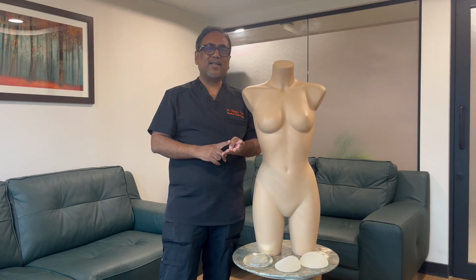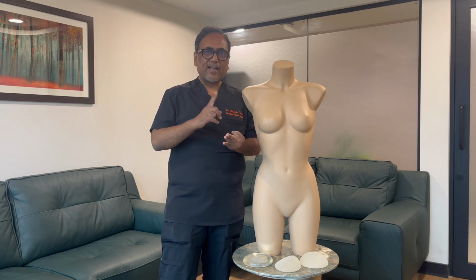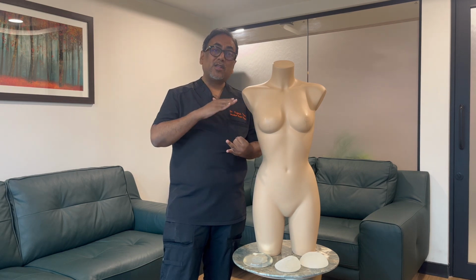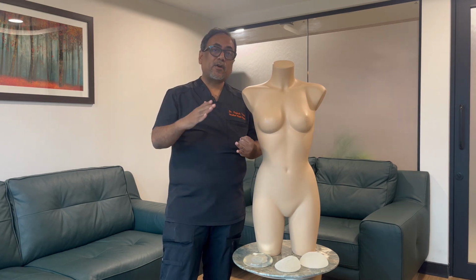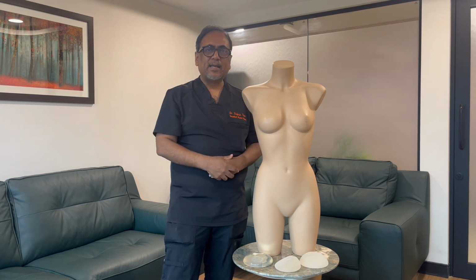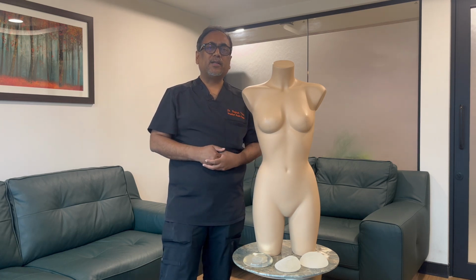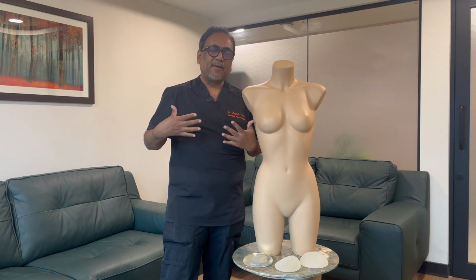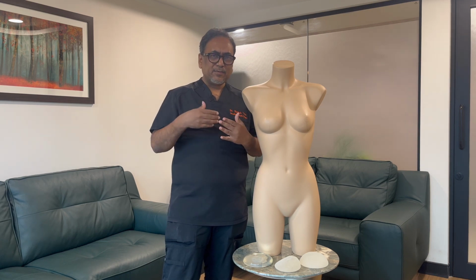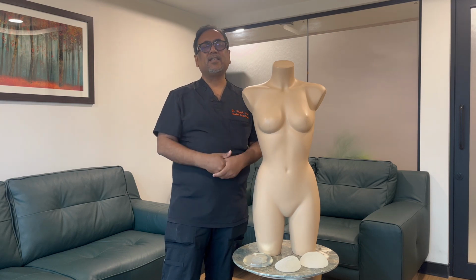So this is what happens in our practice. The first process is getting to know our patients, getting to know their expectations, whether they're realistic, whether they're exaggerated, and then educating this patient, removing all the mysteries and myths which are surrounding breast augmentation. And then we do the physical examination, take the measurements, and help her to choose the correct implant for the characteristics or the features within her chest. And once we finish all this, then we order the implant and the surgery is done after this.